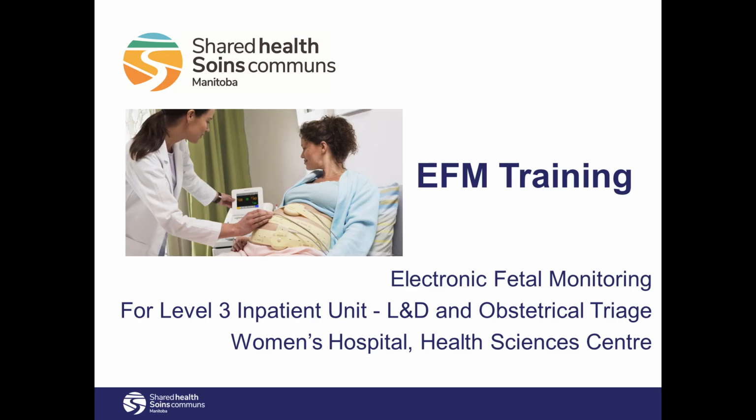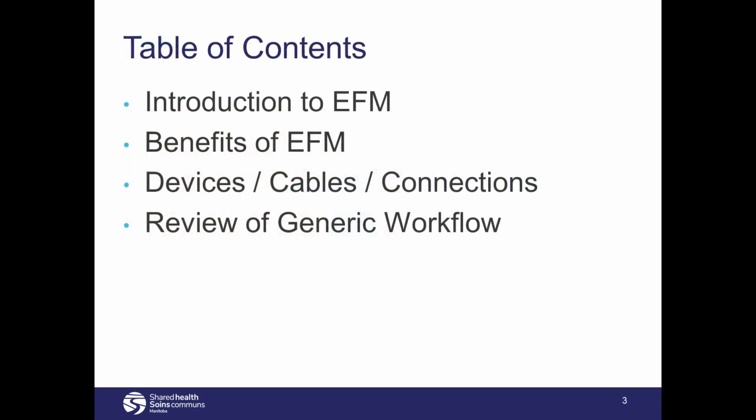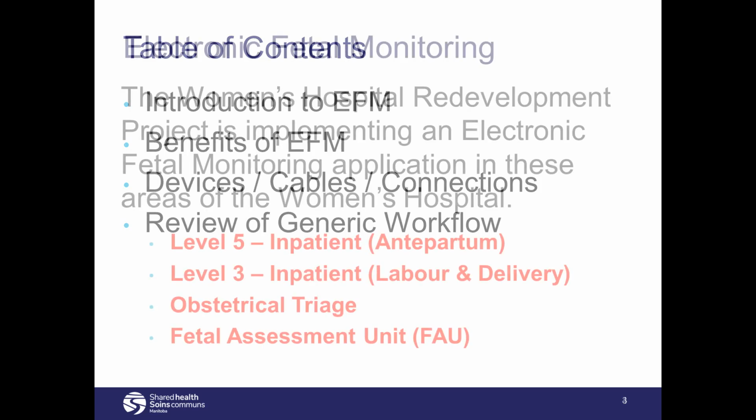This video will demonstrate the use of electronic fetal monitors, or EFM, as it pertains to the implementation in the new Women's Hospital Level 3 inpatient unit. This video will include an introduction to EFM and an explanation of its benefits, an overview of the EFM devices, monitors, cables, and connections, and a review of a generic workflow for your unit.